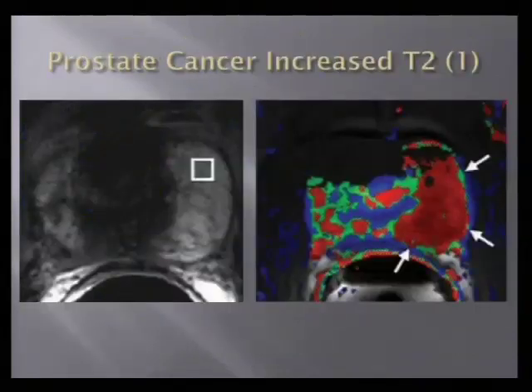So here's an example of a quandary. You might look at this with just the T2 and say, oh, well, on the left, that's not prostate cancer. Things don't always read the book. It can have increased T2 signal. This is an example of that from the literature. And then you can see no one would look at that color map and say it's normal to have that much rapid washout asymmetrically all throughout the prostate.